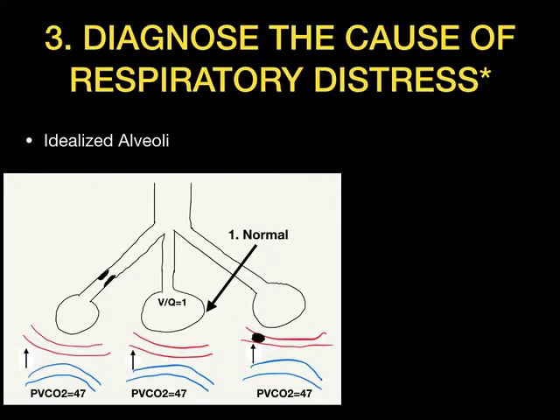The middle alveoli we're going to talk about as being normal, remembering that at normal, our ventilation and perfusion aren't mismatched and are about the same. So our PaCO2 here is going to be 40. In our next alveoli, we're going to give it COPD. So it's going to have an obstruction to outflow.